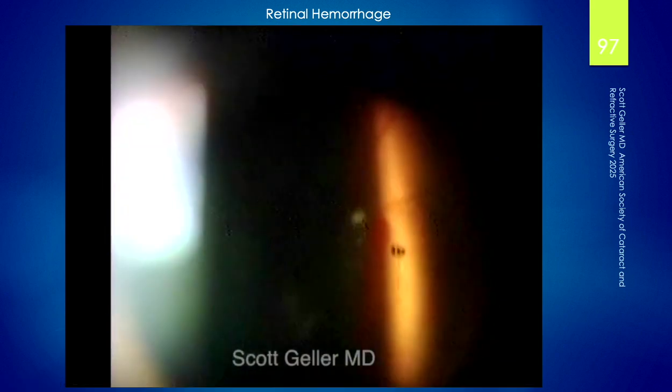You can see right there, I was working close to the retina on this one little opacity that had escaped me from a previous session. The laser was slightly, maybe off axis. It was near the superior arcades, I believe. And I probably was using maybe multiple pulses, which creates more thermal energy to the choroid. And let's do this here.